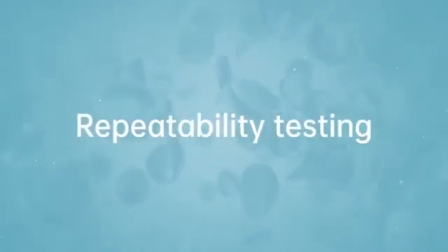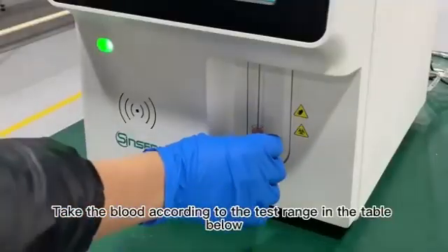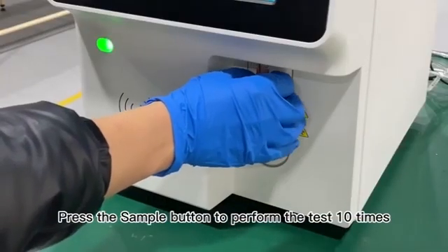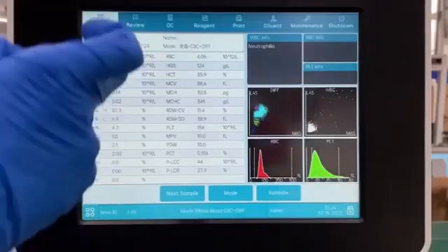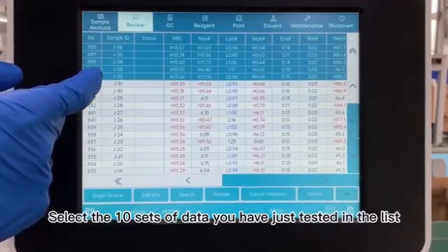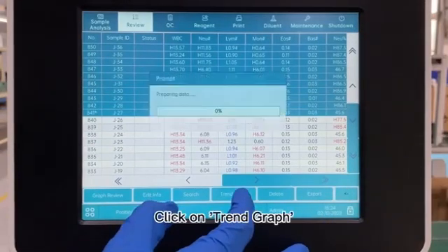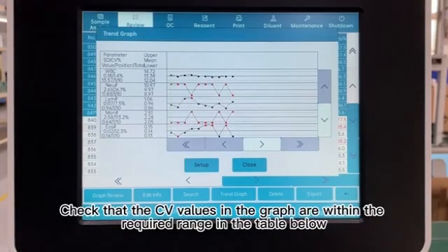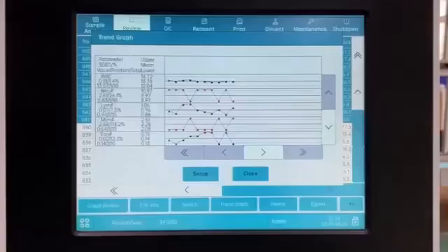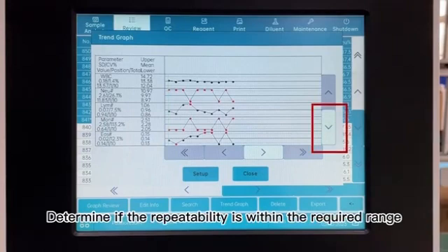Repeatability Testing. 25. In the Sample Analysis screen, select Whole Blood Mode. 26. Take the blood according to the test range in the table below. Press the sample button to perform the test 10 times. 27. When the test is complete, select the list to review. Select the 10 sets of data you have just tested in the list. 28. Click on Trend Graph. Check that the CV values in the graph are within the required range in the table below. Click on the arrows to the right to see more items. 29. Determine if the repeatability is within the required range.